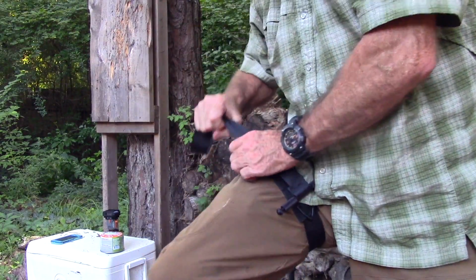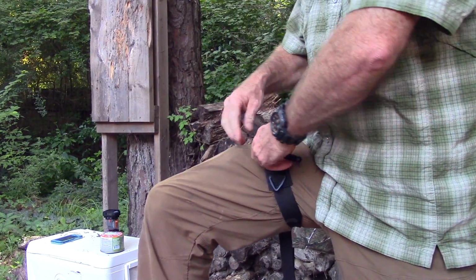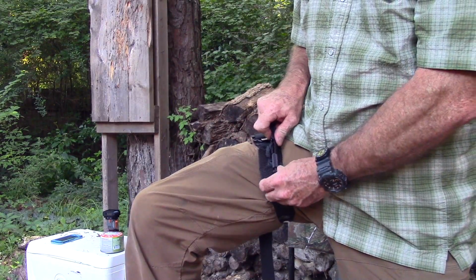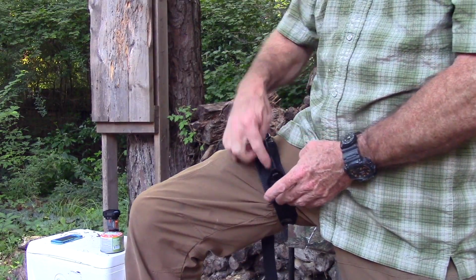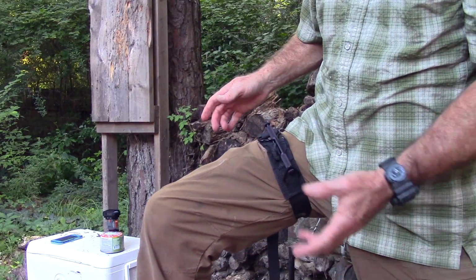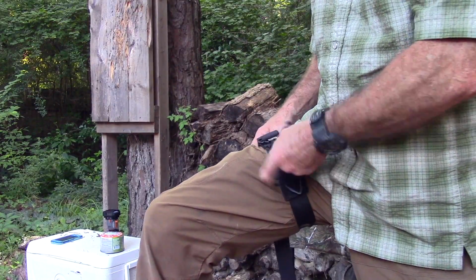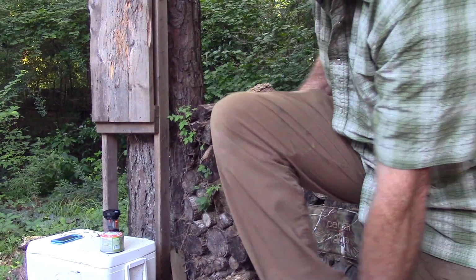Then just pull it tight like so. Once you get it tight, you just start winding this thing up, and it cinches down really pretty quickly. And on the SOFTT here, once you get it as tight as you can, you clip it on that little ring here. I think the CAT actually has a fabric loop, but you'd probably want to go a couple more rounds, and then there you go. That's good. This is pretty easy to use. It's not hard to use one-handed either. So that's on your leg.